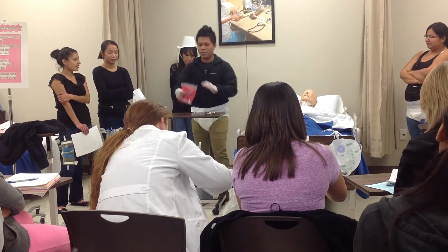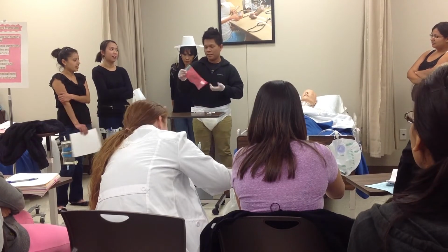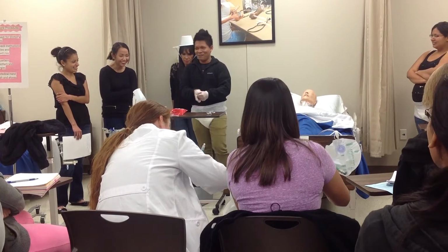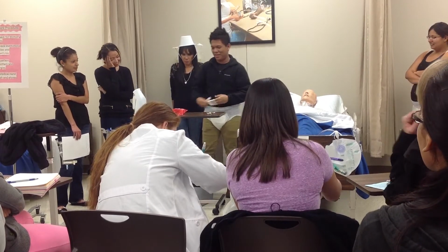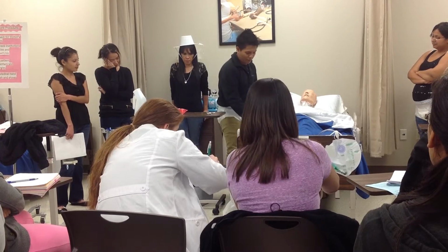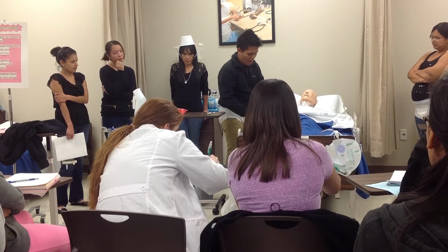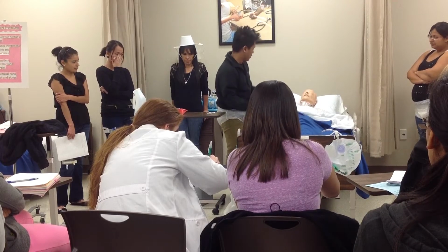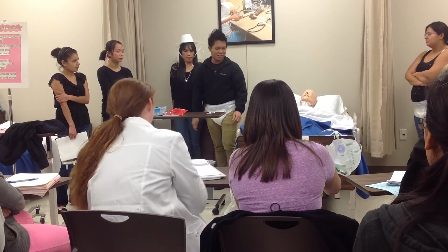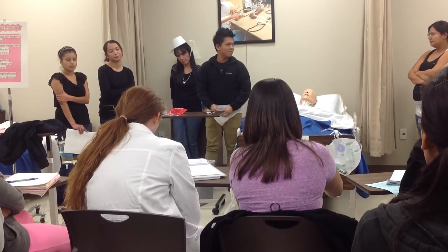So what we're gonna do is send this to the lab within 15 minutes. Dispose of that glove to glove, skin to skin, then medical hand wash. Then you unclamp the tube, take the rubber band off, and tell your patients, is there anything else that we can do for you or stuff like that. Then we're gonna go ahead and go to the nurse's station and document it.